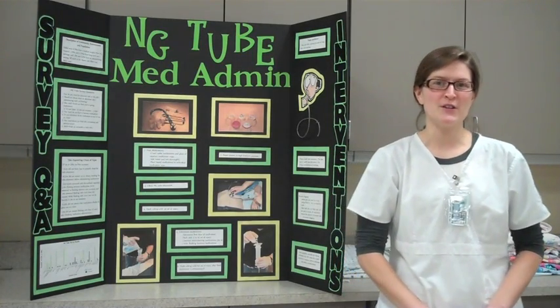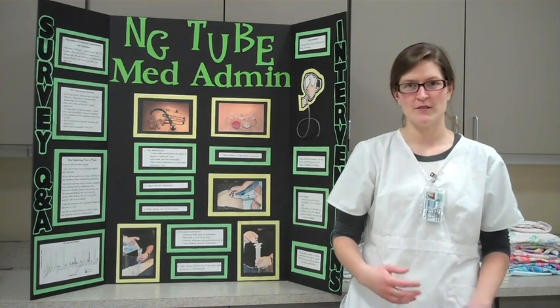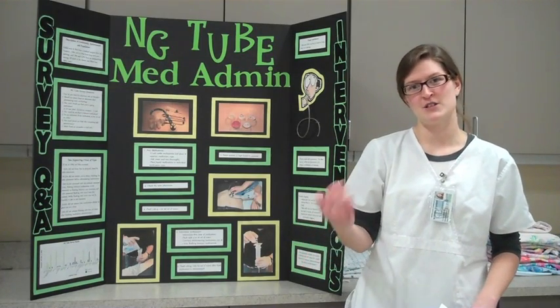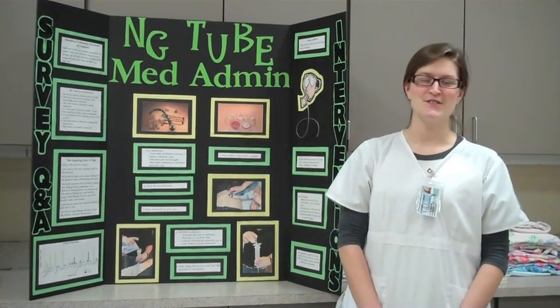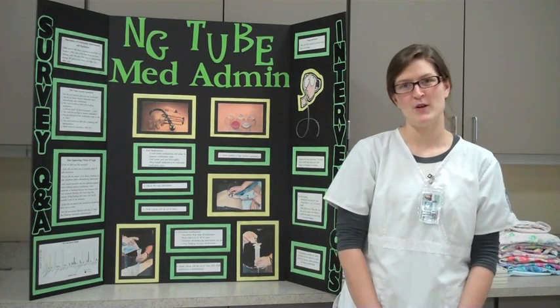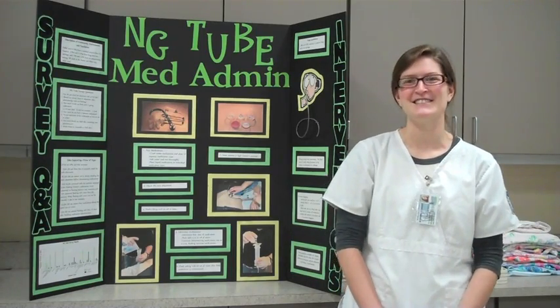NG tubes are used for two main purposes. One purpose is for taking content out of the stomach, and the other for administering medications or nutrition into the stomach for patients that cannot receive it orally. They're used in situations where the intestines need to rest, for example, bowel obstructions. In this video, we're going to show you how to properly administer medications through an NG tube.